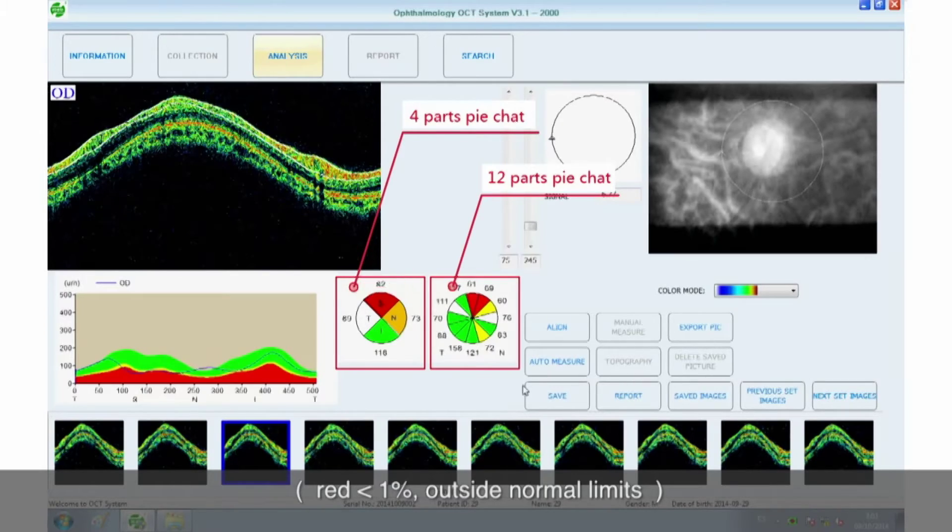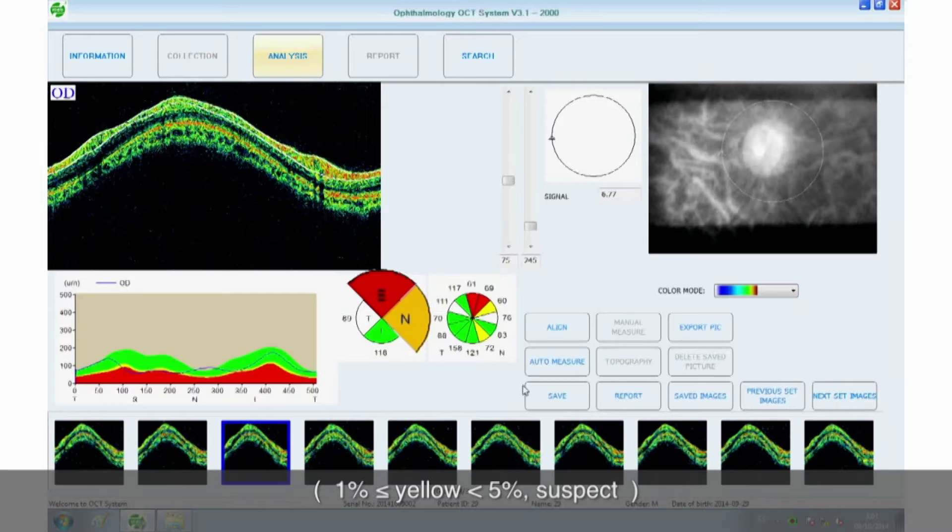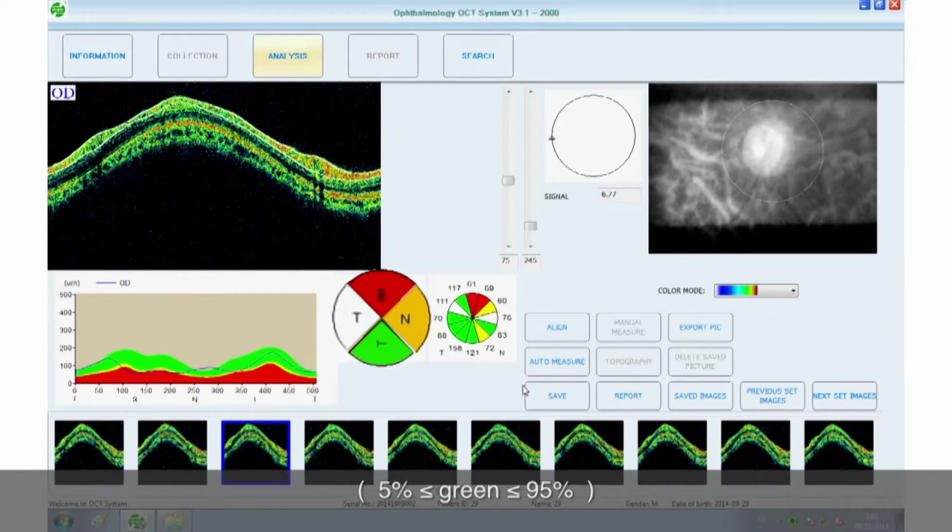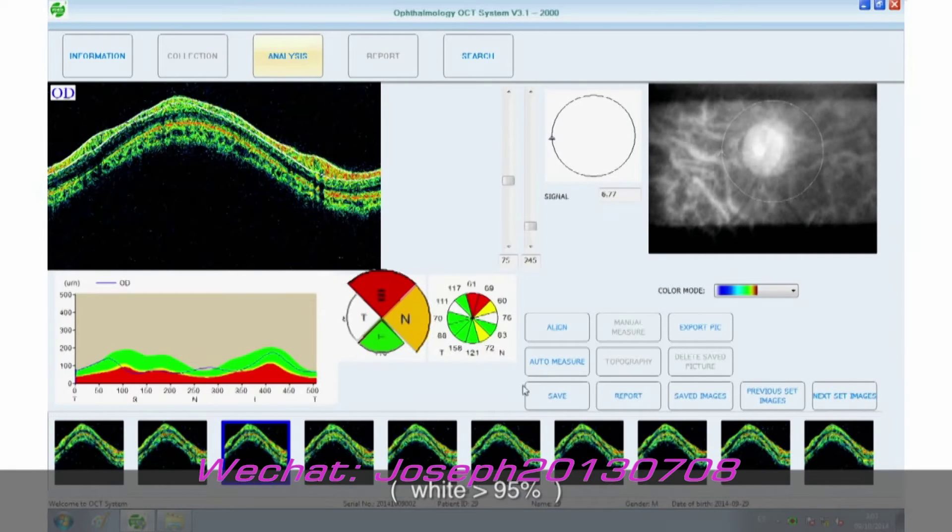The thinnest 1% of measurements fall in the red area. Measurements in red are considered outside normal limits. Red less than 1% outside normal limits. The thinnest 5% of measurements fall in the yellow area or below. 1% less than or equal to yellow, less than 5% suspect. 90% of measurements fall in the green area. 5% greater than or equal to green, equal to or less than 95%. The thickest 5% of measurements fall in the white area. White greater than 95%.